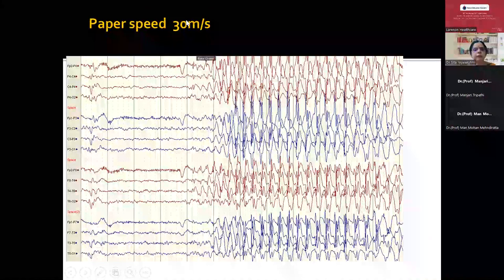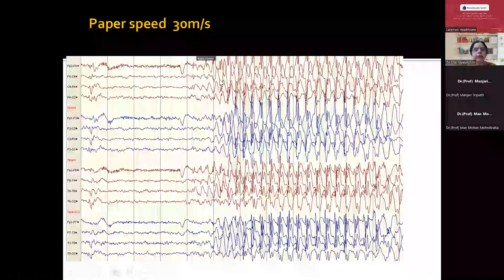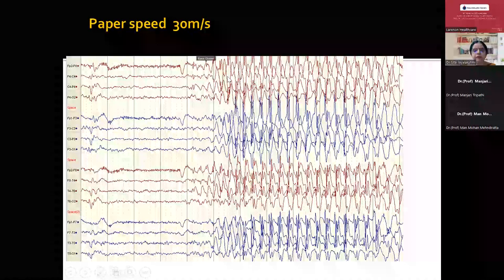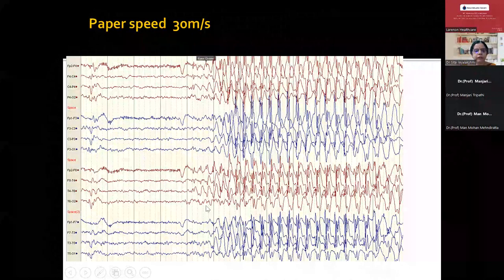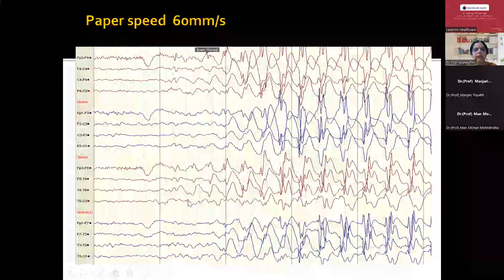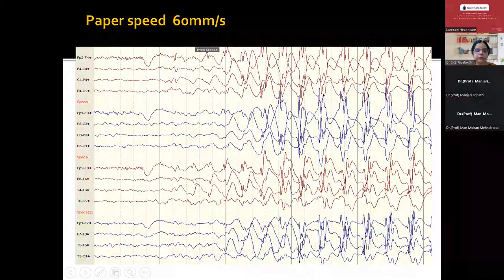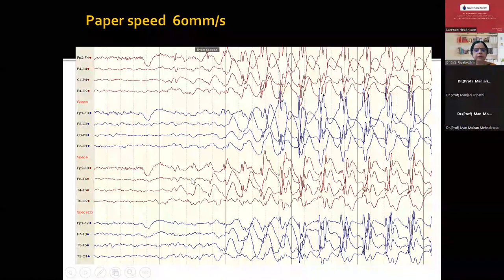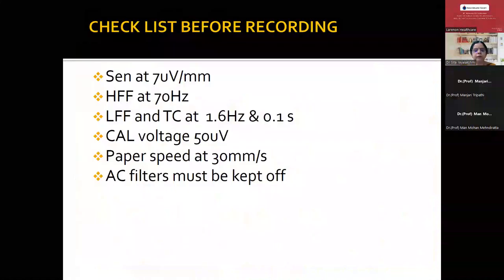At a paper speed of 30 millimeters per second, we can see some asymmetry just in front of generalized discharges — the right side discharges starting early. When you make it 60, we can nicely confirm that it is definitely coming from the right side. By adjusting paper speed, we can always make sure to identify mild early asymmetries, pre- or post-ictally.